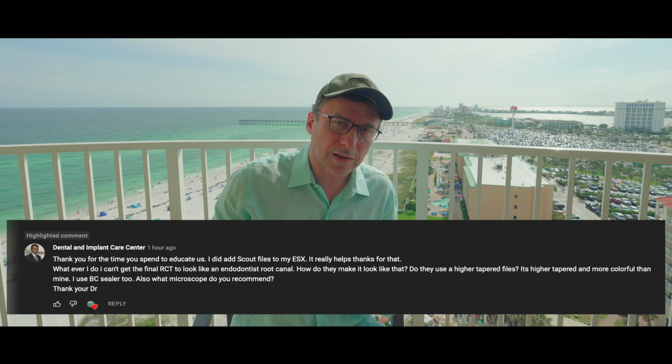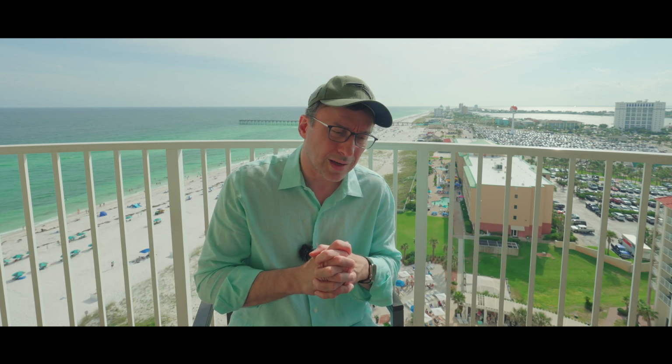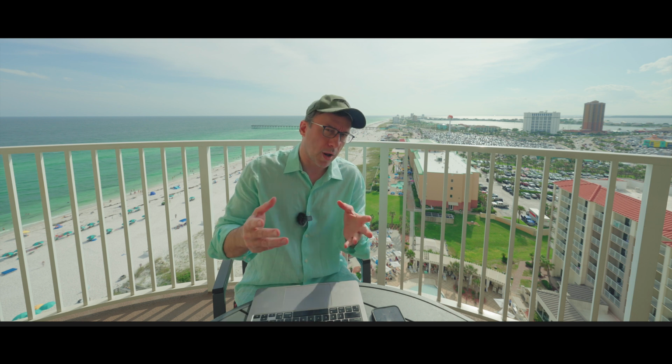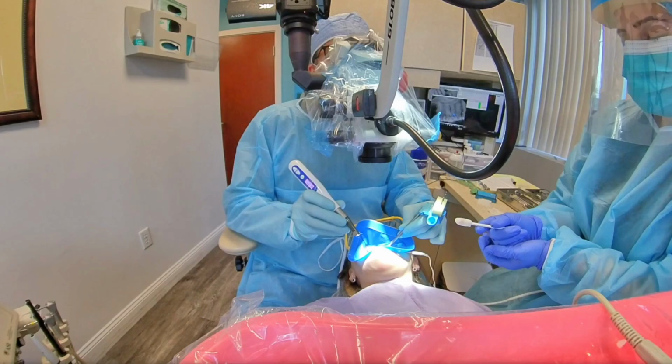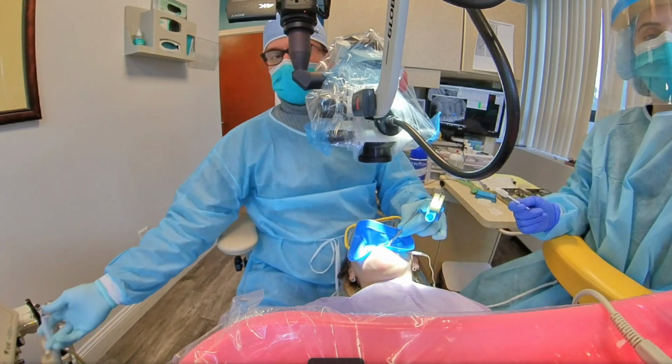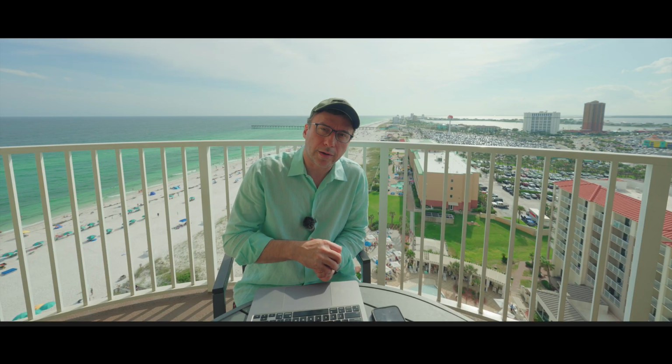Thank you. As far as the last question, what microscope do I recommend? There are many scopes out there, and all of them are good in their own way. It depends first of all on your budget, and then on your priorities. If the optics are more important, if the arm is more important, if the service is more important, all of those are valid concerns. I would say you need to find out what kind of scope is available in your local area and which scopes are best serviced in your local area, so you can get the best scope that matches your specific geographical area. There's no universal answer as far as that is concerned.